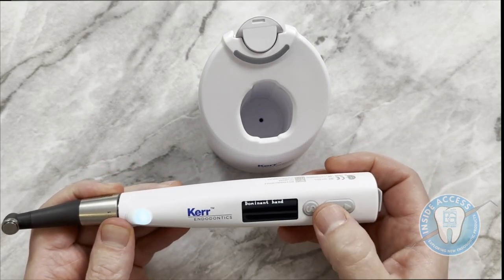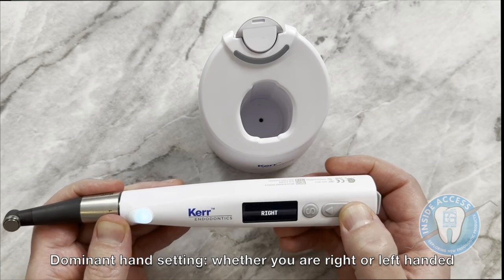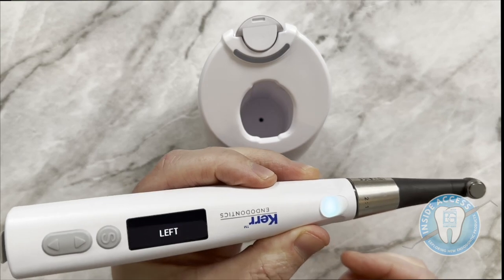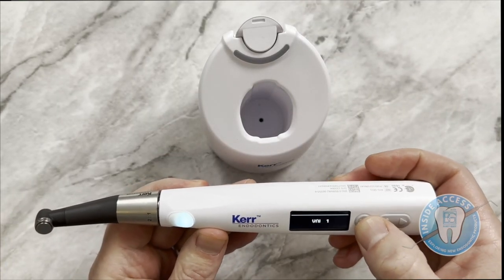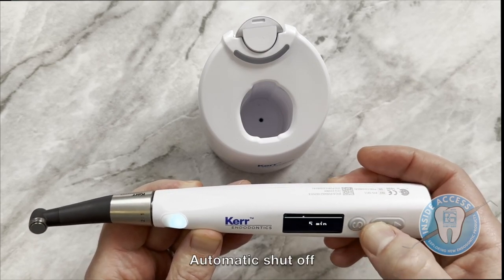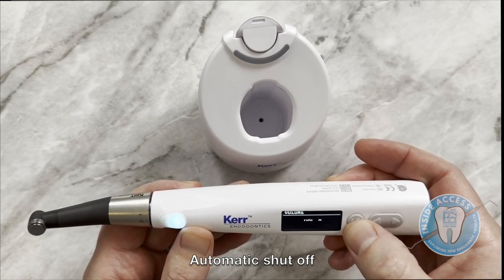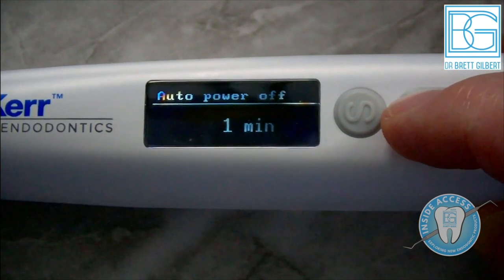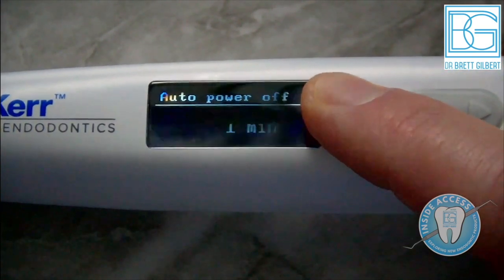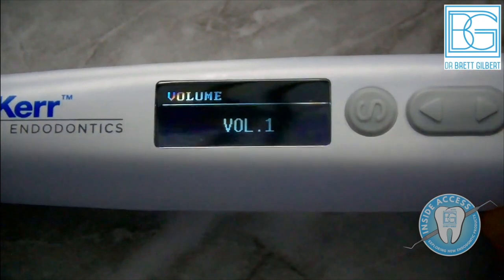One cool feature I like is the dominant hand setting. If you're right-handed, the screen can flip so it really serves you as you're working. You can also adjust the volume up or down, or leave it at zero. The auto power off can be set from one minute all the way up to ten minutes — whatever works best for your practice to conserve battery power.